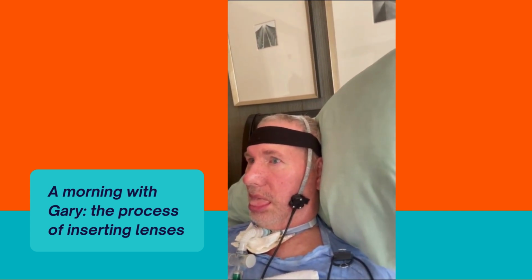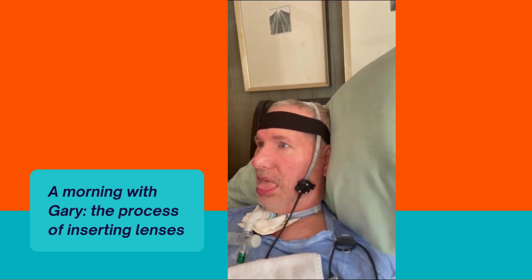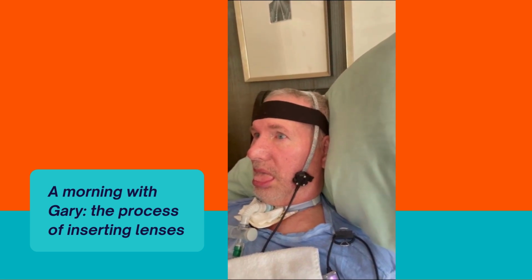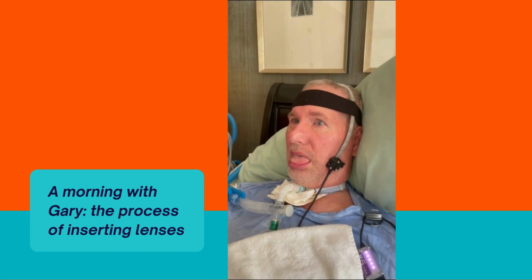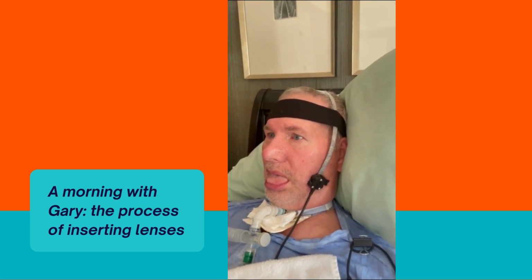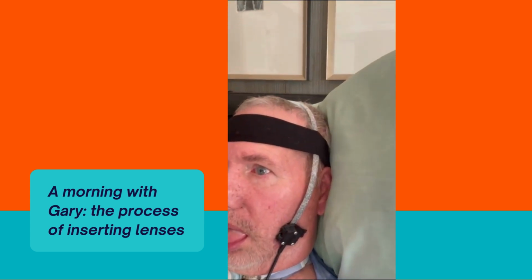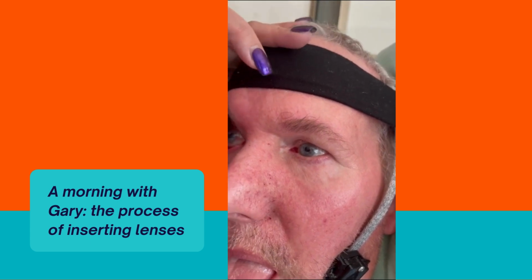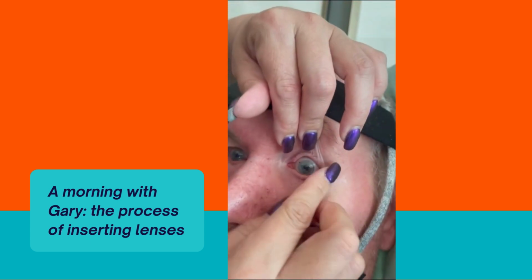Okay, can you show me one more thing, Bernadine? Sure. Throughout the day, she may need to do two things. One, she might need to position the lenses and spin them to get the bubbles toward the top. She'll show us how we do that. Actually, it's good because the one on the left has that issue right now, because we didn't straighten it out for you earlier. See how the dot is not at the top? So she's going to spin that.